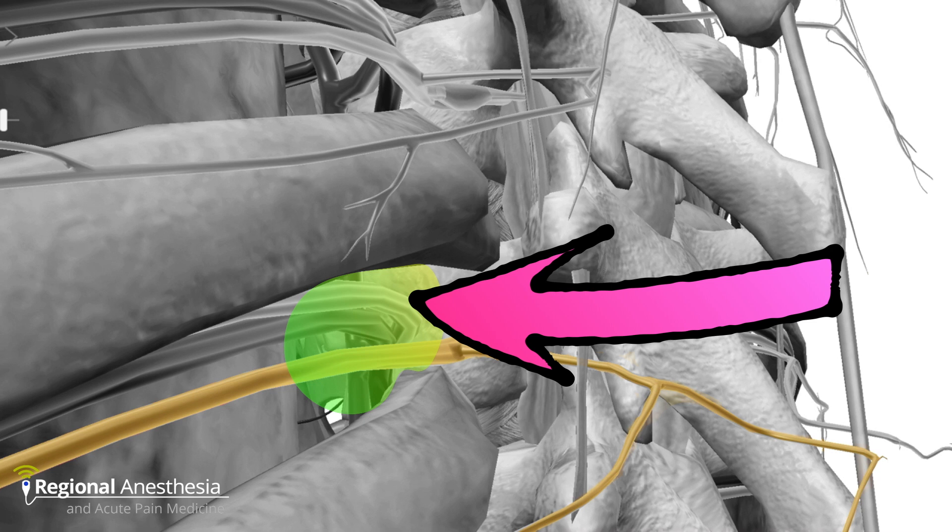Note that local anesthetic placed here will also reach the thoracic sympathetic nerves, which aids greatly in treating visceral pain.